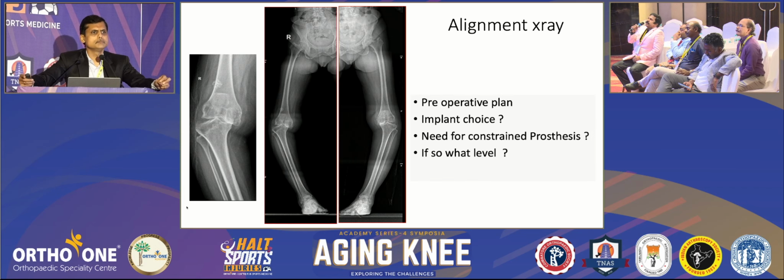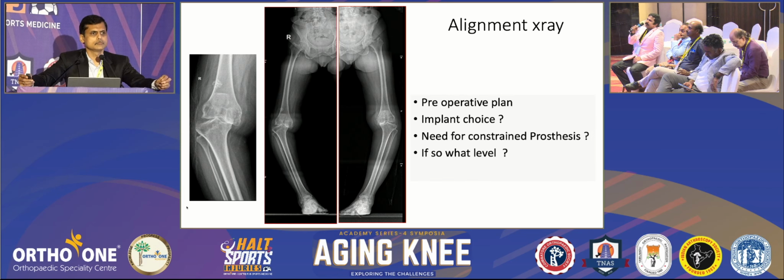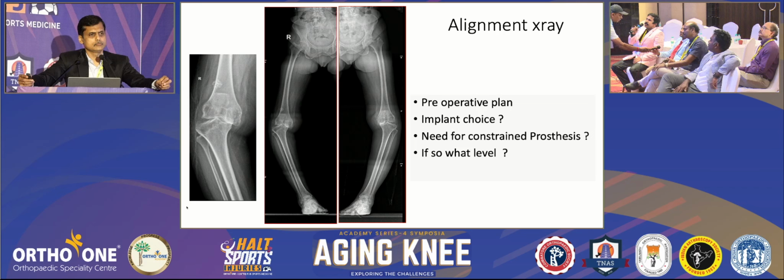And obviously, in this case, you'll expect the flexion and extension gap both to be huge. So the laxity will be more than the defect. In other types of varus, you'll get huge defects, posteromedial defect or medial defect. The posterior half of the condyle will be defective. In that case, the moment you fill the gap, you'll get the balancing. But in this case, it is going to be big laxity, so you have to be very, very conservative in your resection. Cut less and fill the gap with implants.